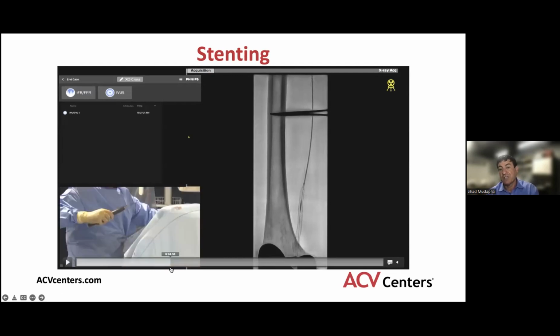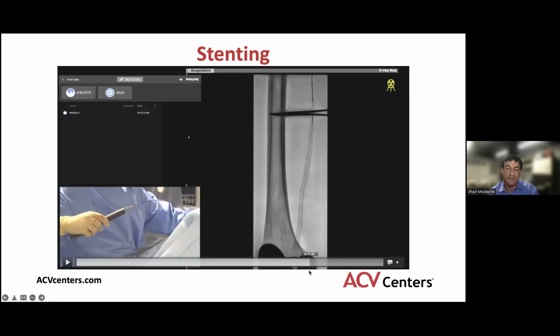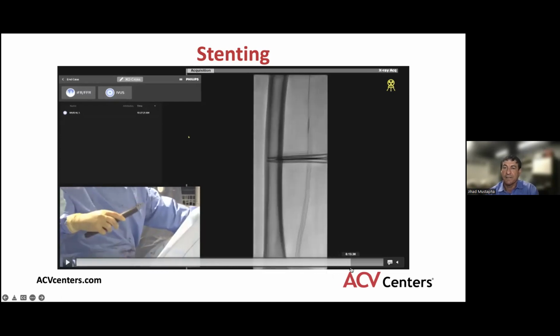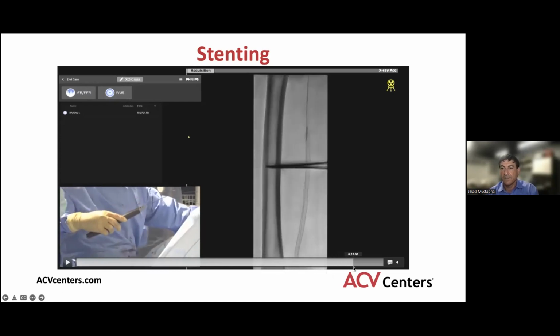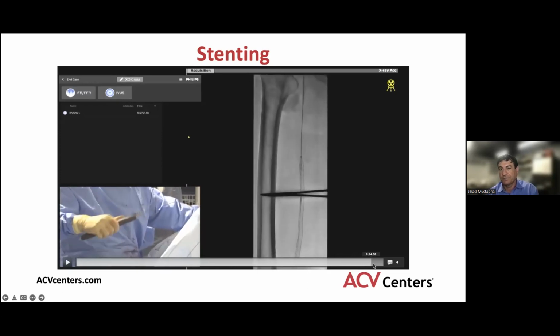As you can imagine here, we pre-dilated this area again with a 7.0 balloon to deploy a 6.5 millimeter stent. And notice how the geometry of the stent is very symmetrical. Based on published data, this is the kind of stent deployment result that will give you the best patency in the long term.